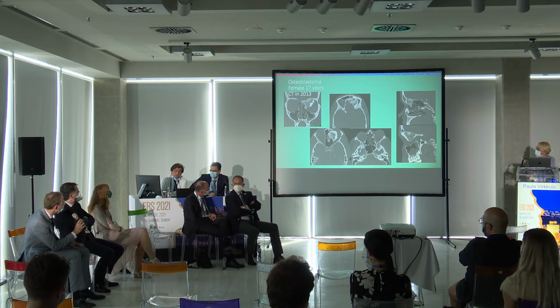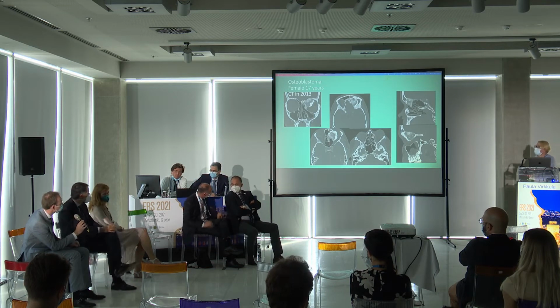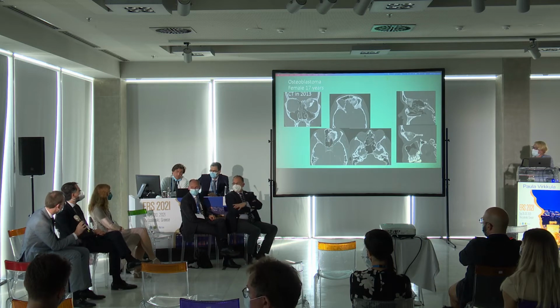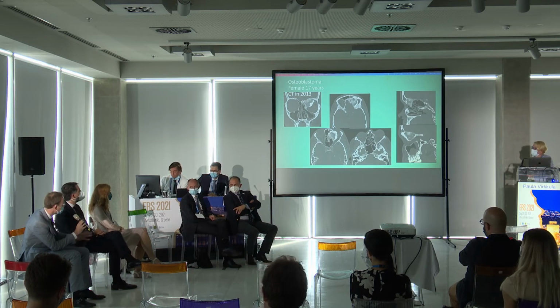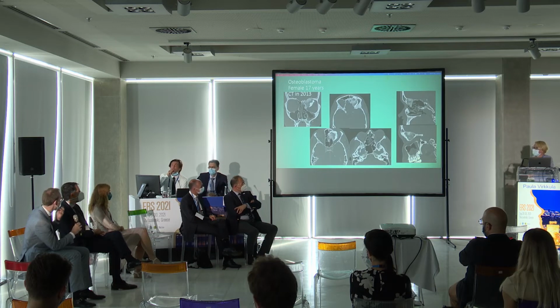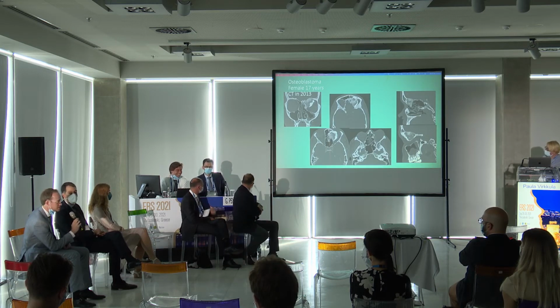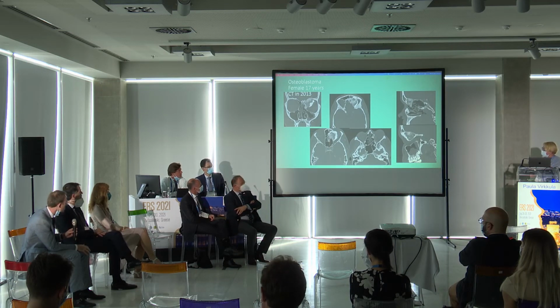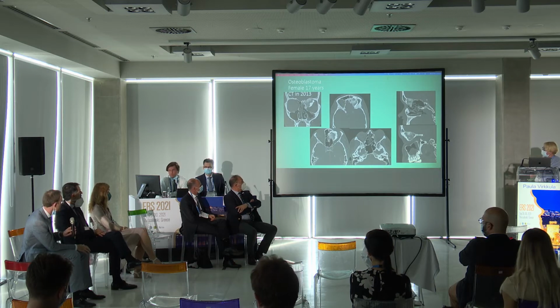And even if I'm doing this operation in a 17-year-old girl, maybe I find myself in the position that I cannot reach all the tumor, but it's probably benign. I already have pathology. First see what the pathology is, and then decide radical or watch and scan. Because fortunately, for 8 years already, it doesn't grow. And we have scanned it with CT several times, much better, so it does not have any signs of a mucocele. It's the flap inside the frontal.